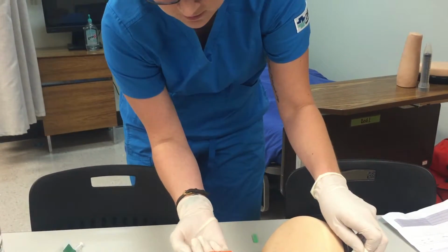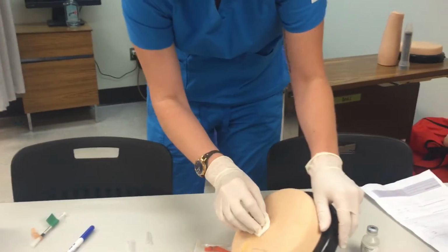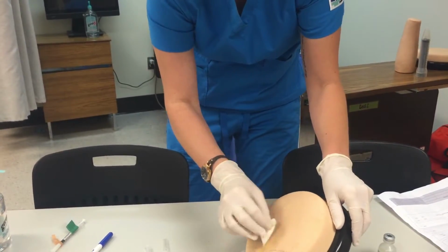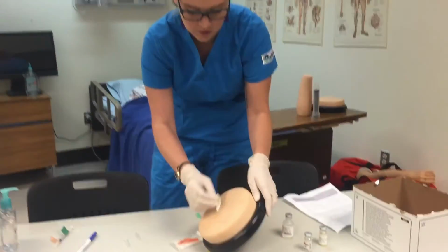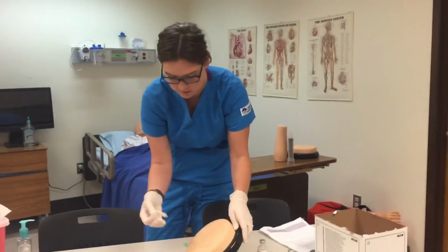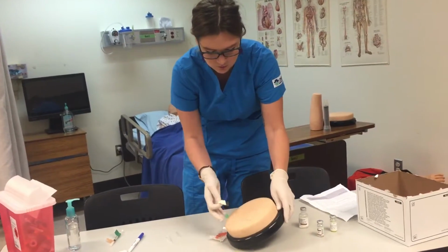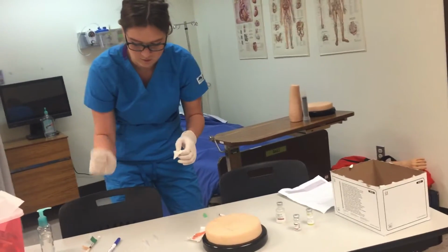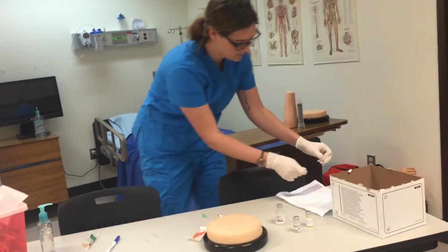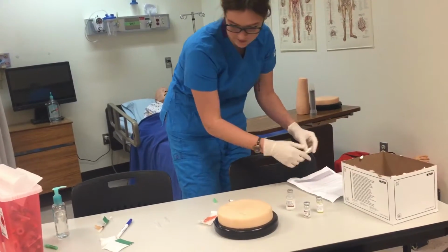I'd pull the needle, put the safety on the needle, and dispose of the needle. Clean it, hold it for a little bit until they can clot, and put a Band-Aid on it. I'd watch for any reactions, and I would make sure my patient was okay. Watch for signs of shock. Some people get a little squeamish. Okay, so I would write on my MAR, I would initial and sign and put the time and date that I've done the influenza vaccine.